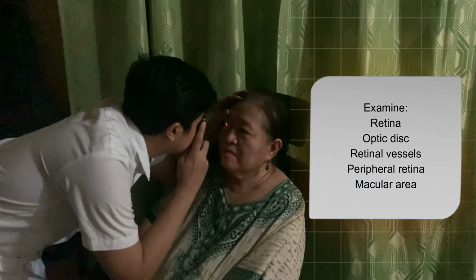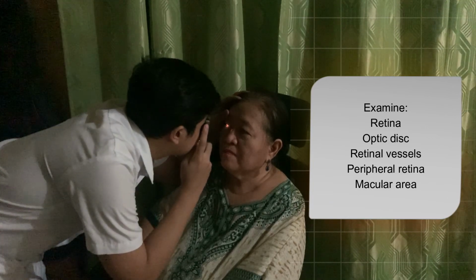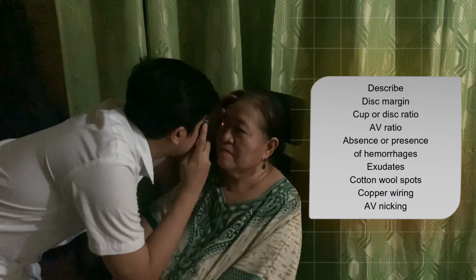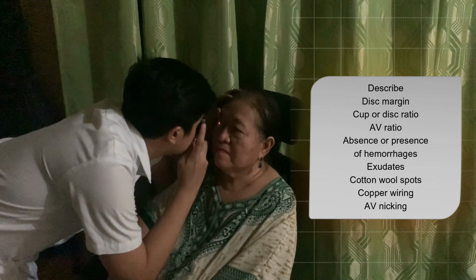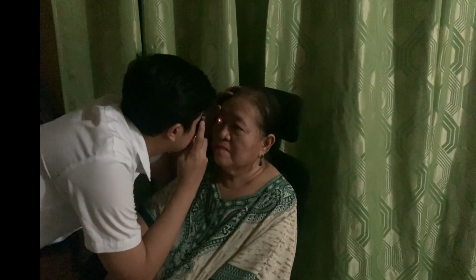Examine the retina, optic disc, retinal vessels, peripheral retina, and macular area. Describe the disc margin, report the cup-to-disc ratio, AV ratio, absence or presence of hemorrhages, exudates, cotton wool spots, copper wiring, and AV nicking. Report and interpret findings.